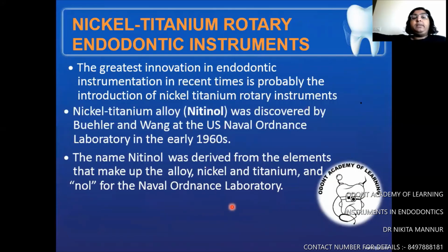Nitinol instruments are the latest advancement. I mean, latest compared to, let's say, somewhere in the 1960s, 1970s, when we started using nitinol instruments. Now we have advances in nitinol instruments as well, where we have something called M-wire technology and P-wire technology. What exactly this technology is has not been explained. The companies have it as a trade secret, but they have again made a lot of advancements in nitinol itself. The greatest innovation in endodontic instrumentation is the nitinol instruments.